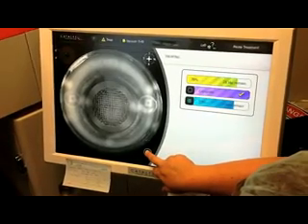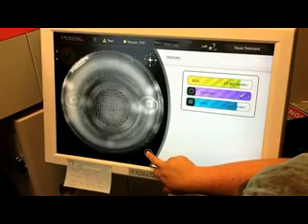It also uses a laser that's very, very fast and very brief. It's called a femtosecond laser, and it's among the fastest reactions in the natural existing world. I tell people 1 femtosecond is to 1 second as 1 second is to 36 million years. I think that's the analogy. So it's a little bit of time.